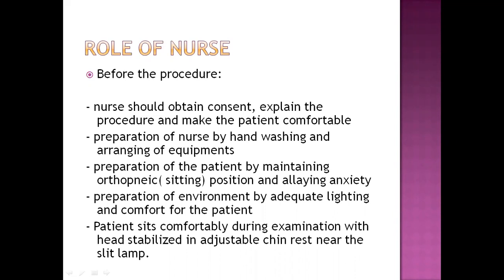Next preparation is preparation of nurse, same thing, hand washing and arranging the equipments. Preparation of patient by maintaining correct position and trying to allay anxiety of the patient. Preparation of environment can be by adequate lighting and providing comfort to the patient throughout the procedure.